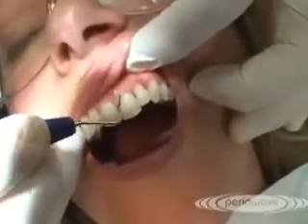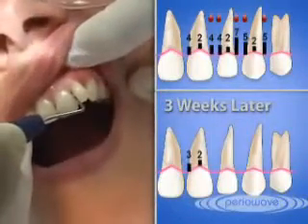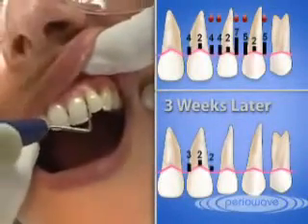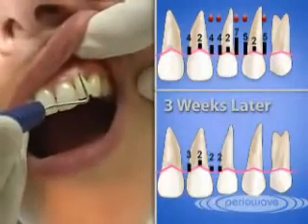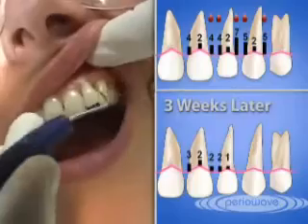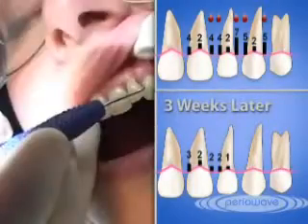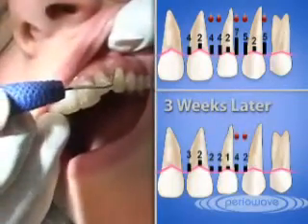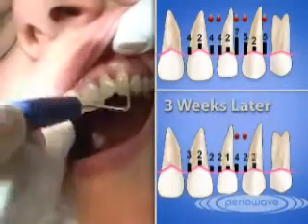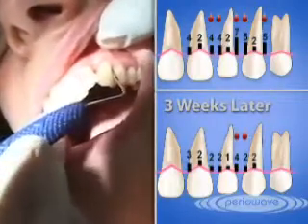Three. Two. Two. Two. Any pockets greater than four millimeters that bleed when probed should be retreated at three to six weeks. Four. Two. Two. Three.